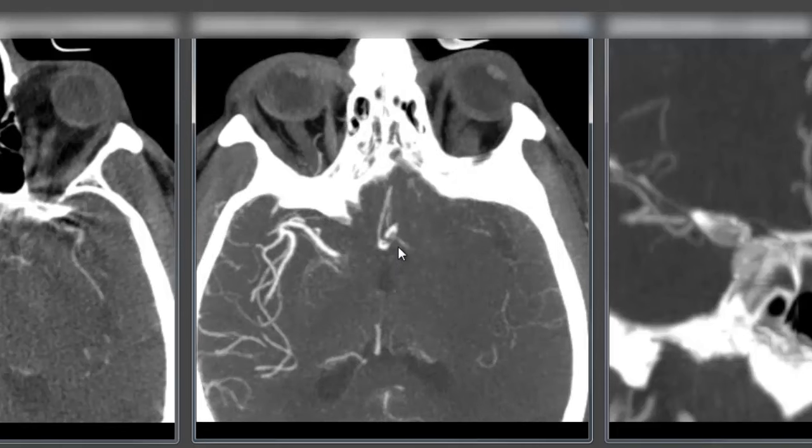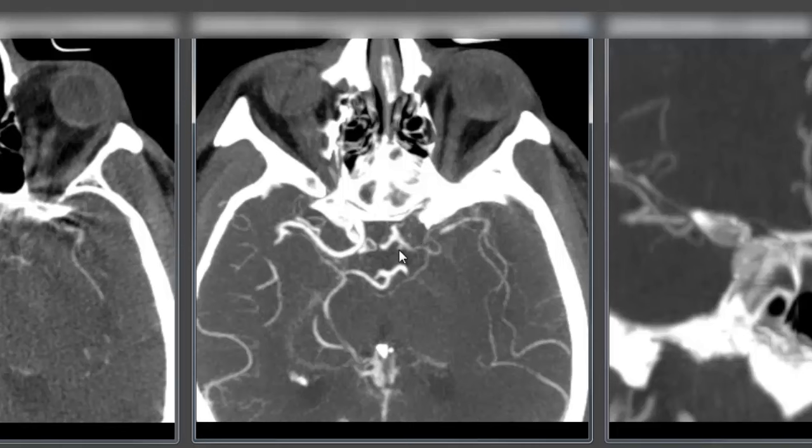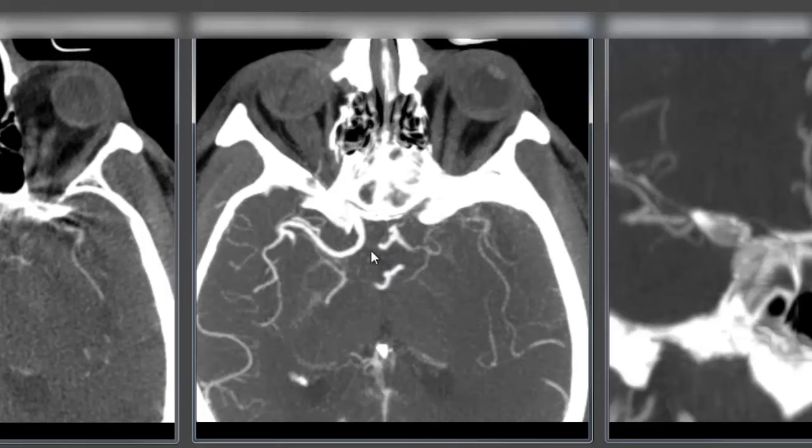There's a small degree of collateral filling or some degree of contrast making it past the clot into the anterior cerebral arteries on both sides as there's no obvious A1 or initial segment of the anterior cerebral artery on the right side, on the unaffected side.